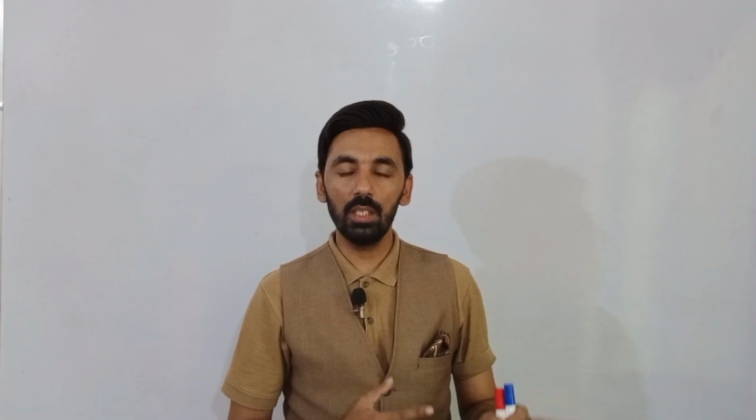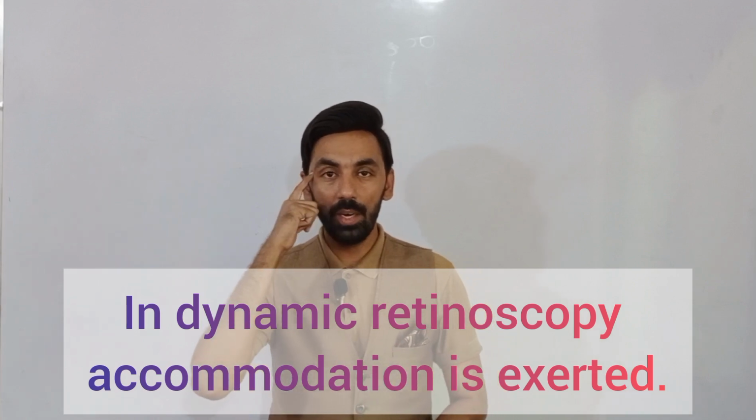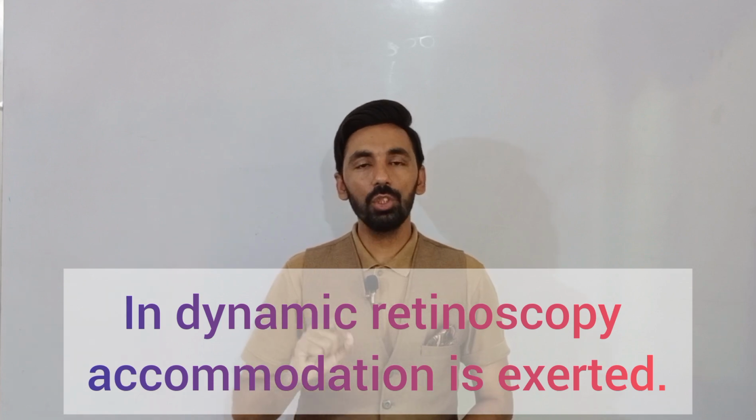On the other hand, dynamic retinoscopy. Dynamic means it is not fixed, it is not static, it is movable, right? So in dynamic retinoscopy, the accommodation is not static, the accommodation is moving, the accommodation is exerting. Keep in mind, this is very important, that in every type of dynamic retinoscopy, the accommodation of the patient is exerted. Accommodation is not at rest, accommodation is not paralyzed, but accommodation is exerted, in all types of dynamic retinoscopy.